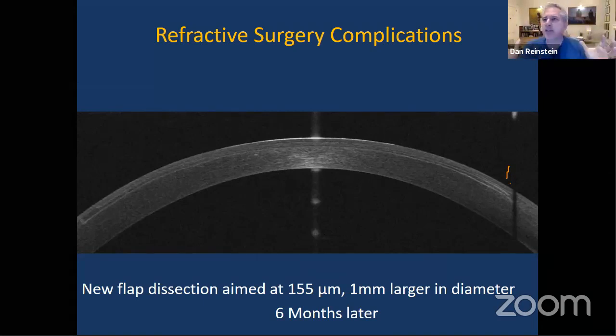So it's just statistics. We teach a lot about second flaps below and above original flaps and all the techniques that we would use to lift those. But of course it's all based on a knowledge of the standard deviations. And just bringing it back to the subject of the evening, the fact that you can image a flap in 3 dimensions with this kind of precision is really special, because it means that the management of complications becomes easy, right? If you have a diagnosis, you know exactly what to do next.